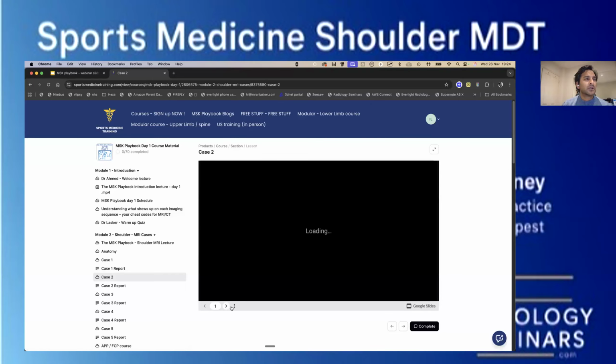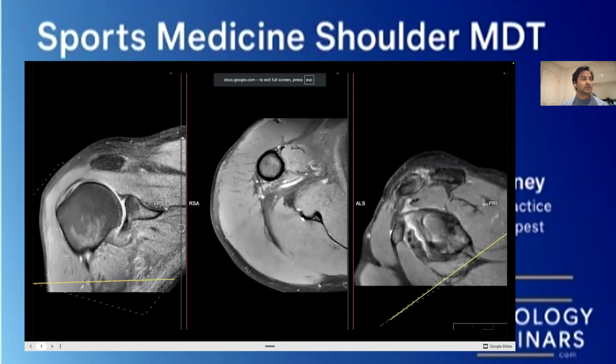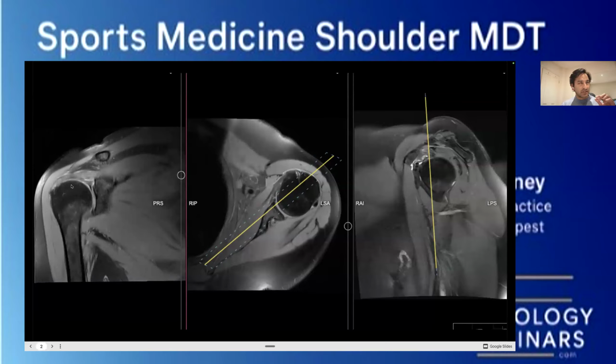Let's have a look. So ideally, you do want to have an arthrogram study if you're looking for labral tears. And so you can say there could be a little bit of, see that sort of fluid level located over here around the origin of the biceps tendon. And that tendon does look a bit abnormal. Do you remember when I was saying it looks a bit abnormal, a bit further up around here, but I wasn't 100% sure because we could be getting an angle. But now we see it on two views, you've got to be concerned that there could be something going on with that biceps tendon as well. So it's going to be tendinopathic, and there may be an underlying SLAP tear or a slight kind of pull of that tendon as it emerges into that superior glenoid. So that is a good spot and correct. Thank you.